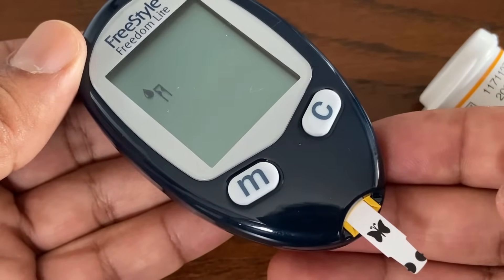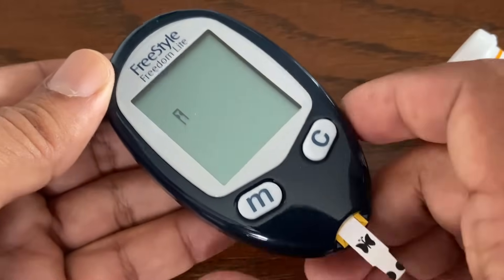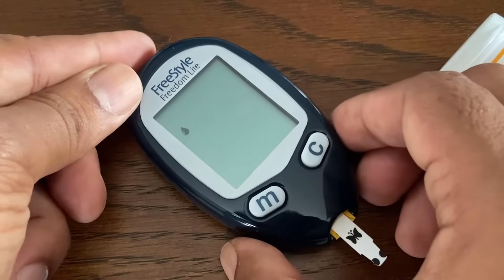No separate step to code the meter is required. Before testing, wash your hands thoroughly with warm soapy water. Rinse and dry completely.